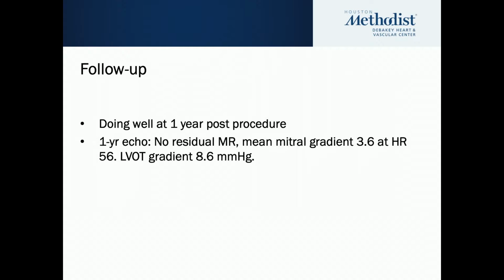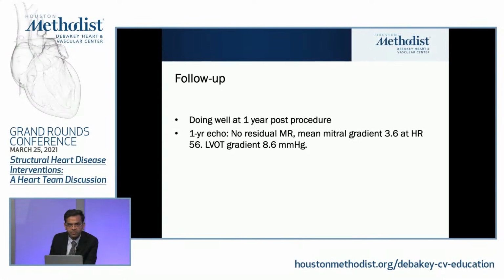1.2. So our patient is now out over a year after her procedure, and we recently reviewed her 1-year echo. She has no residual mitral regurgitation, a mean gradient of 4, and an LVOT gradient of 8.6.